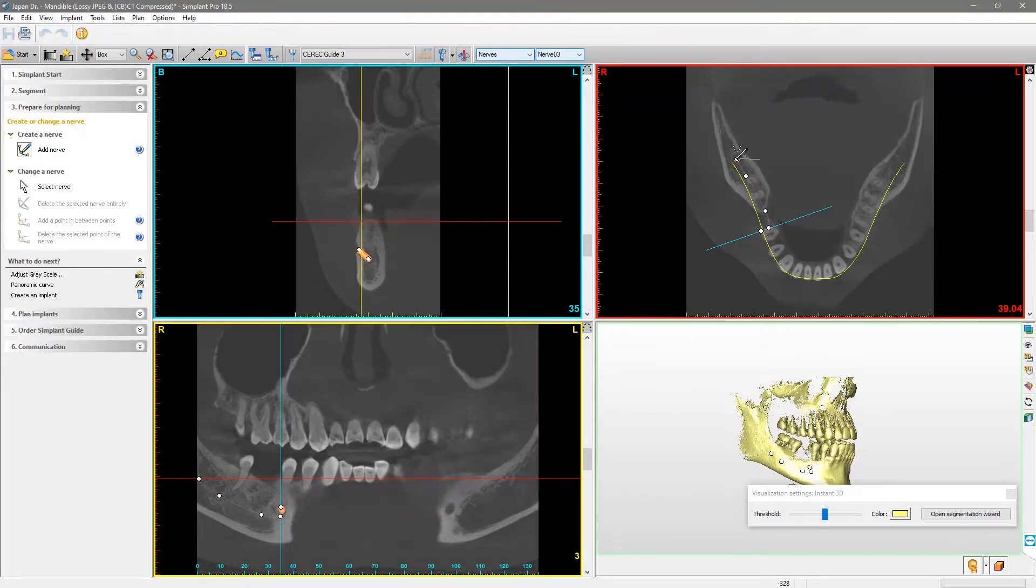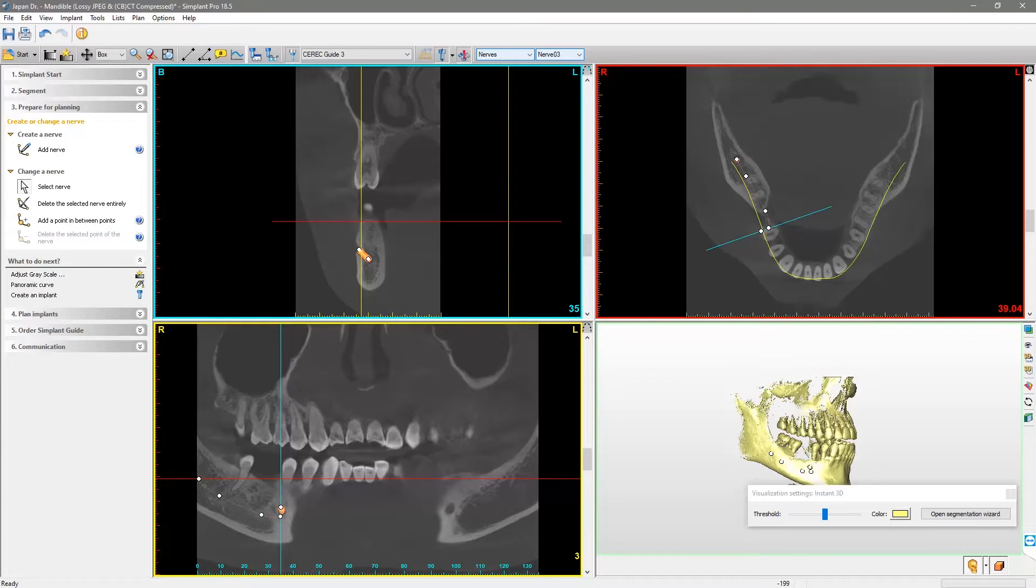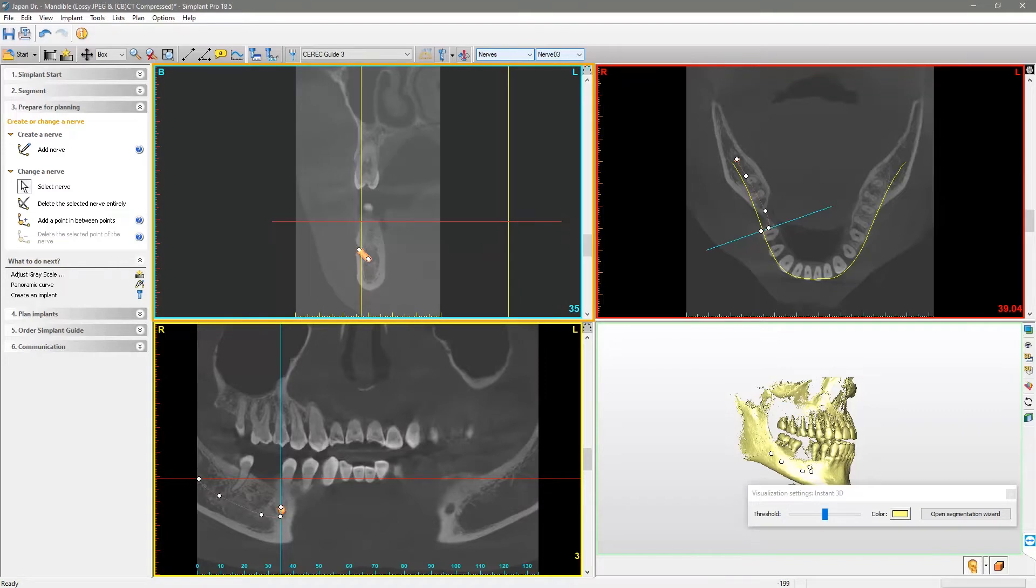After you have placed the last point in the mental foramen, you finish drawing the nerve by right-clicking. If necessary, repeat the drawing of the nerve in the other quadrant. Next, we will scroll through the cross-sectional view in order to review the nerve path.